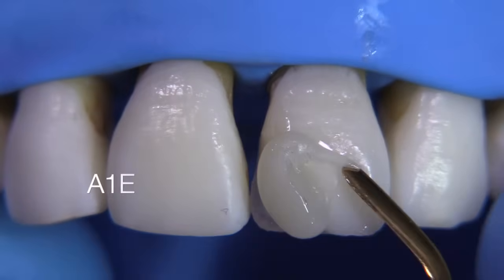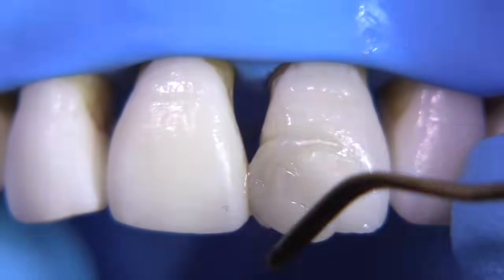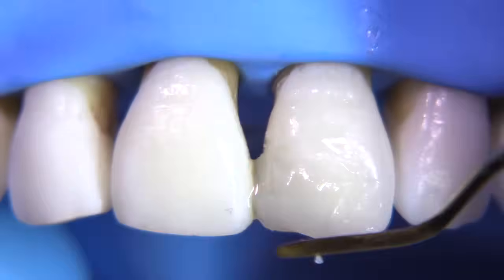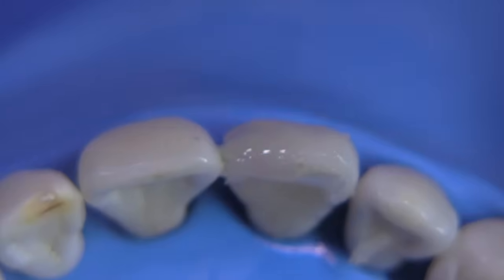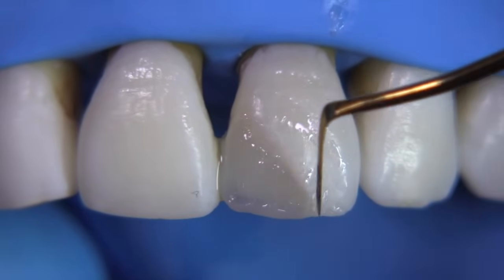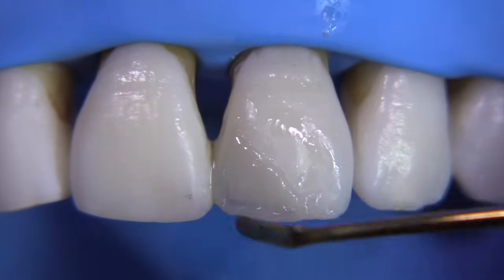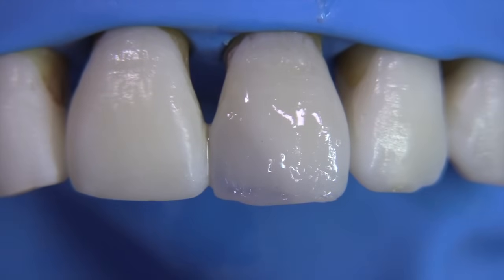Now we have this substructure that's under-contoured significantly. We're going to add to this with an A1 enamel shade. This is a very simplified approach — I'm not using any Teflon tape, just placing the composite right up against the adjacent tooth which has not been etched or treated with bonding material, so we'll be able to make a little cracking move with an instrument to separate them easily. Here's a little channel, and we're going to create some variable depressions to create an effect of translucency on the incisal.